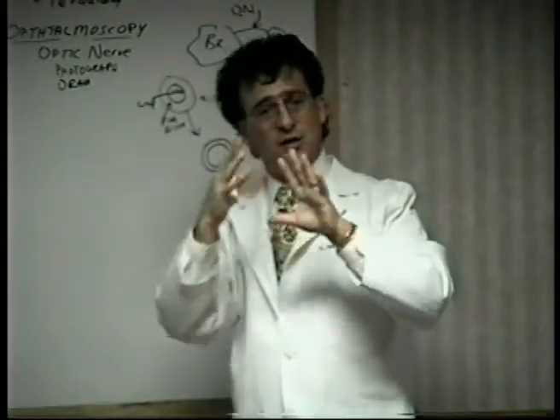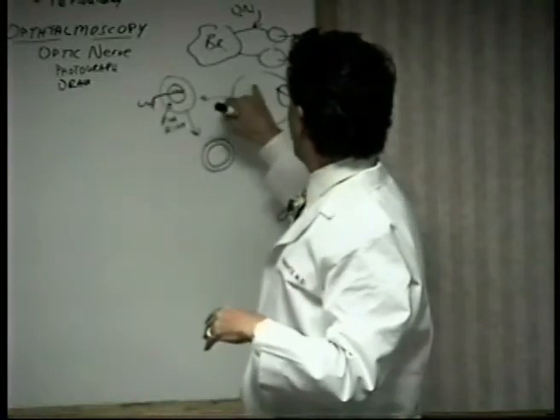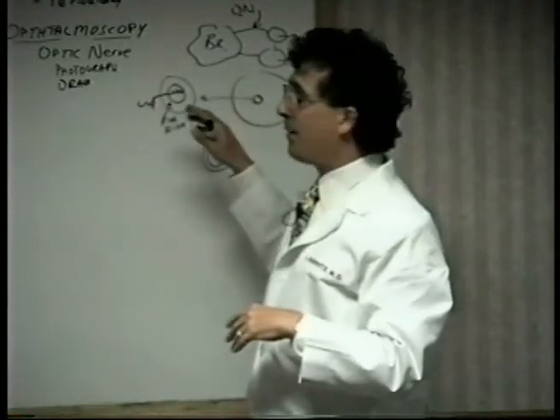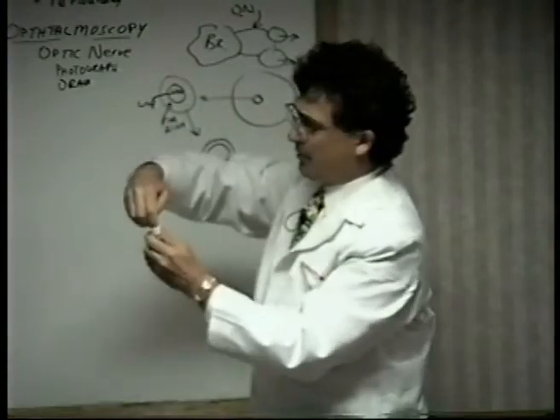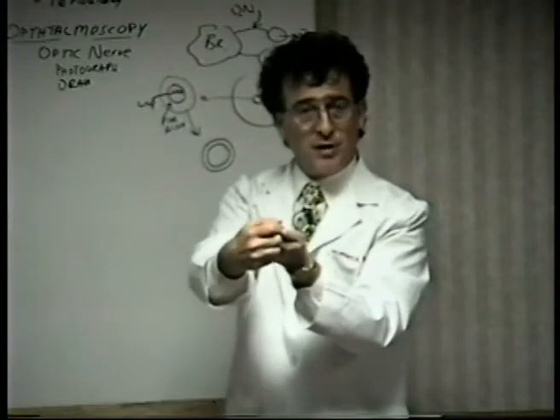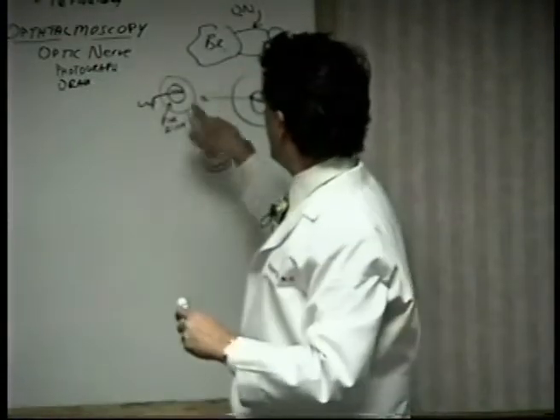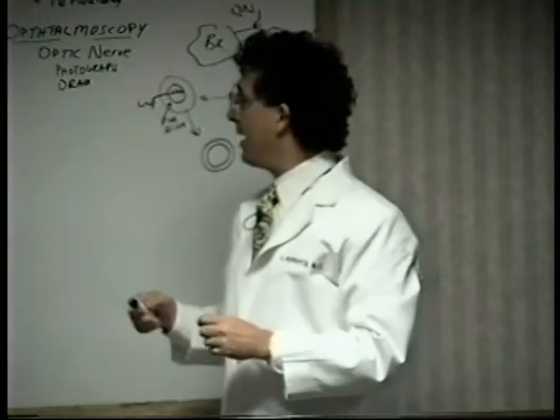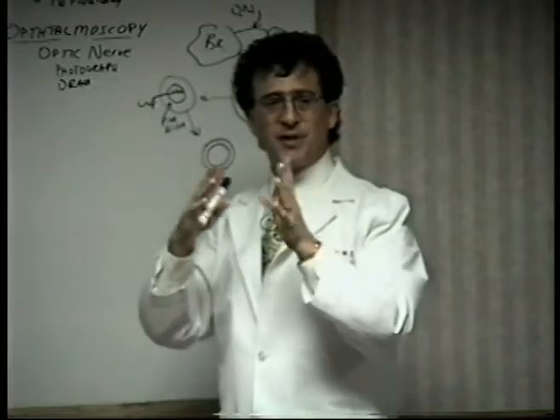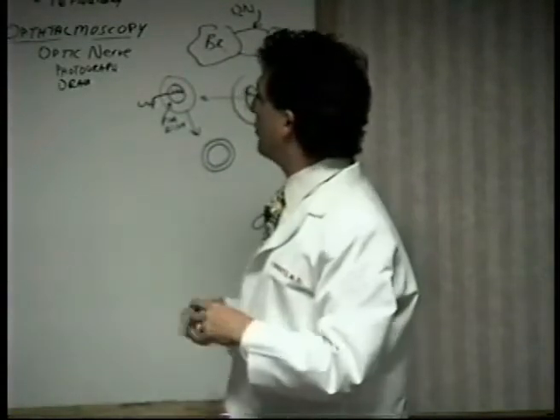Remember, it's a three-dimensional surface, this optic nerve. The retina's flat around it, but the optic nerve can go back. Remember, you're looking at it on end, just like the top of this has a little hole in the center. We draw it, and we make the depth notations and all kinds of things about the shape of that nerve. The stereo photographs we take give us depth perception when we look at them. So we're pretty good at documenting it. The important thing is to do it.